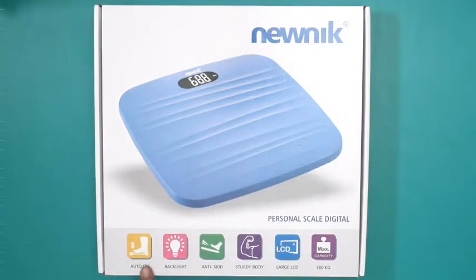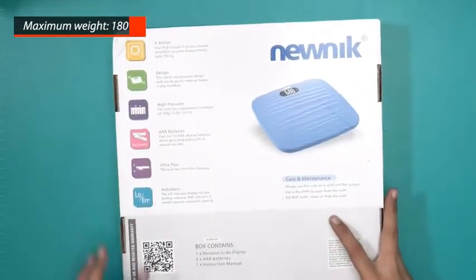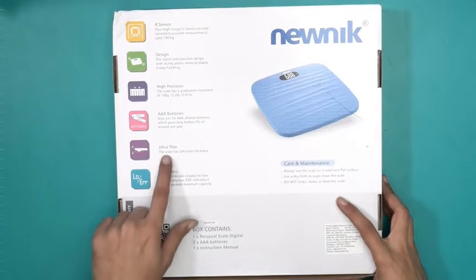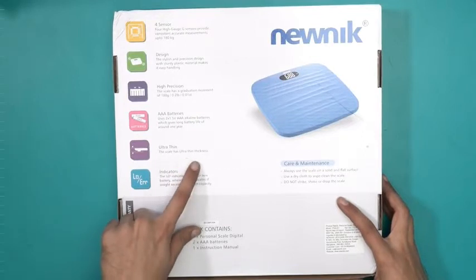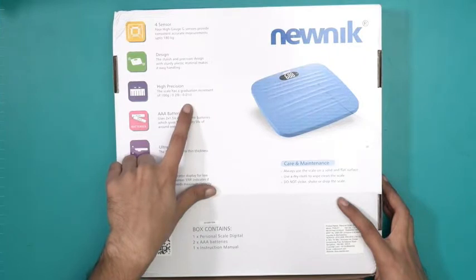This comes with auto-on features, backlight, anti-skid technology, sturdy body, large LCD, and a maximum capacity of 180 kilos. At the back we have more or less the same information. It also says it's an ultra-thin weighing scale, comes with two AAA batteries, and has a high precision scale as well.